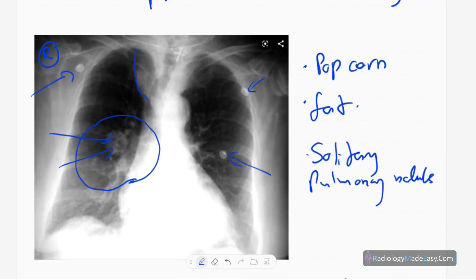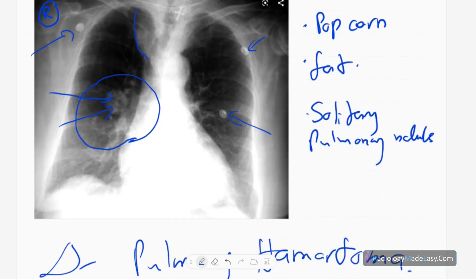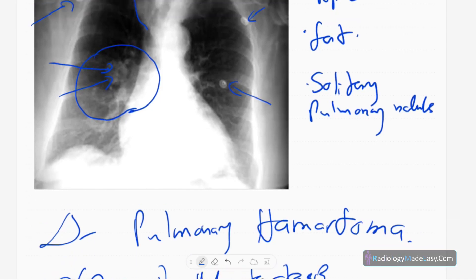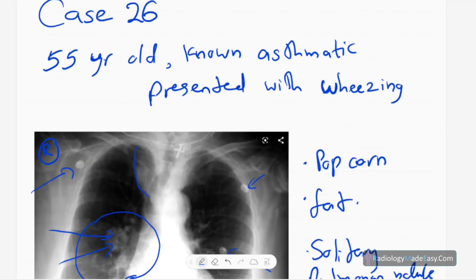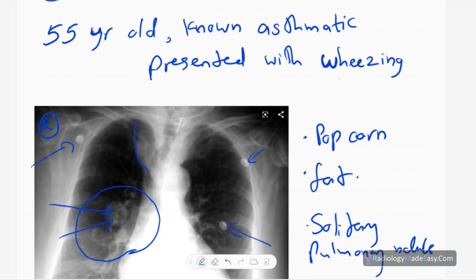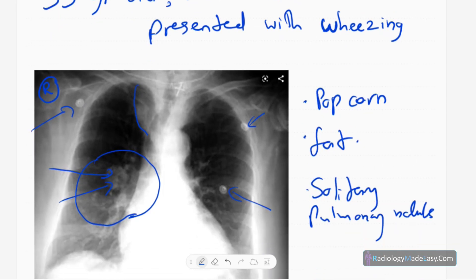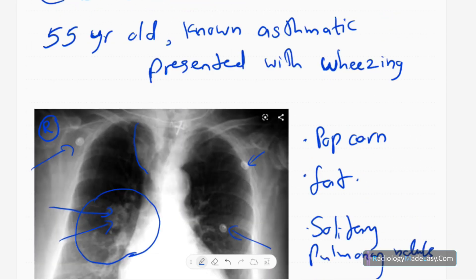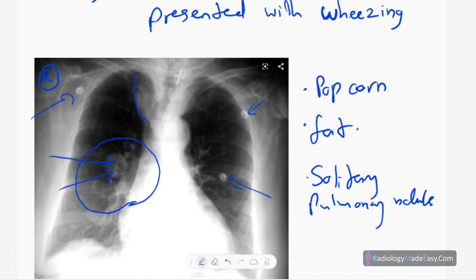Hamartomas are composed of different kinds of tissues — connective tissue, cartilage, fat, and bone — almost all tissue types are represented. That is why it shows fat density and calcified densities on imaging. It is a benign lesion, so no intervention is needed. In this patient, it was an incidental finding discovered on the chest X-ray taken for the complaint of wheezing.